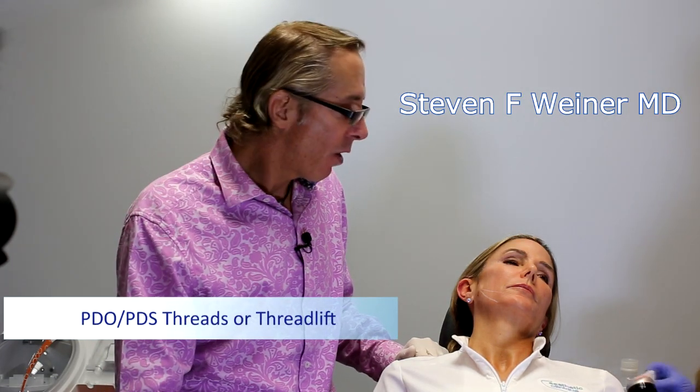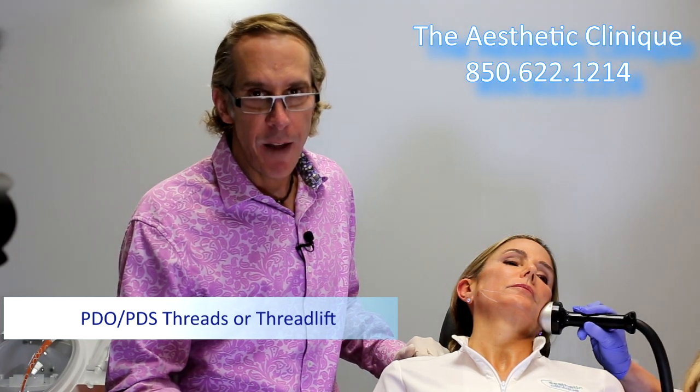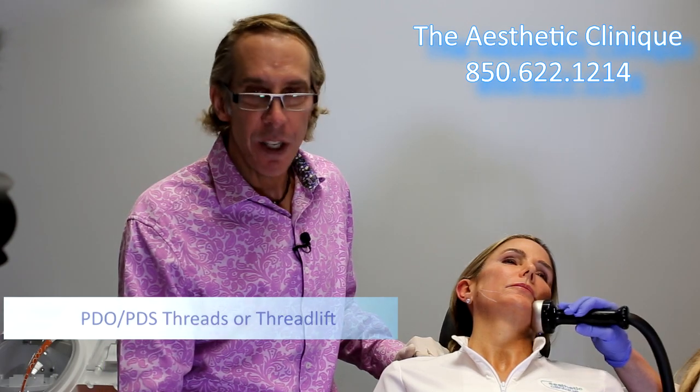PDS threads. So PDO threads are these threads that have been used in operations for at least 30 years, particularly in cardiac surgery. So they're not new to the medical world. But what is new is the use of these threads for cosmetic uses. And what you do is you have 4 different types of threads that are used, and they were developed in Korea as well as in Europe, and they're very popular there now.